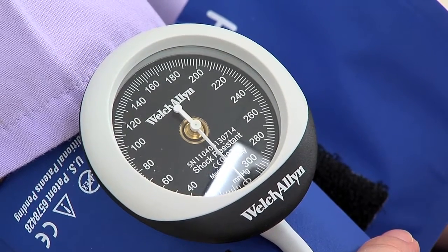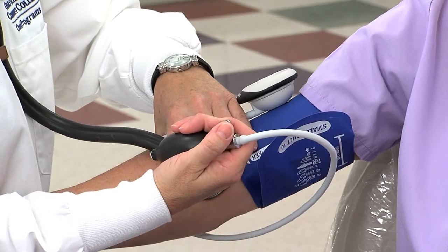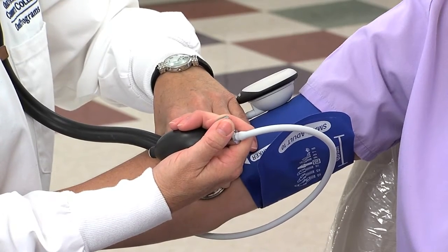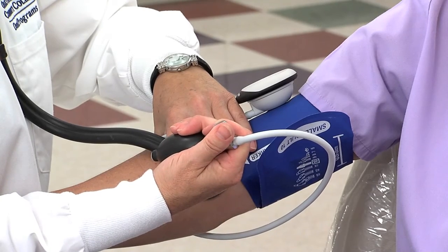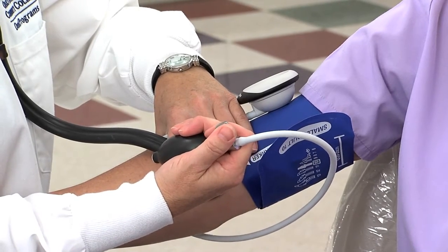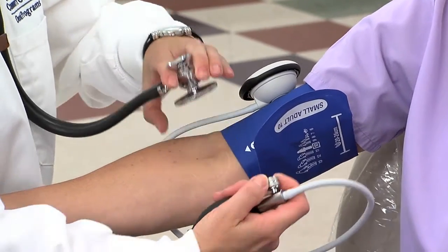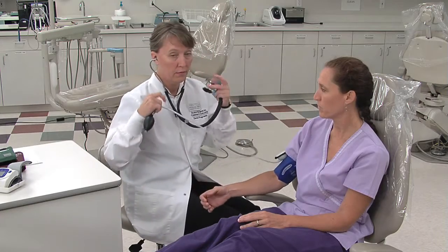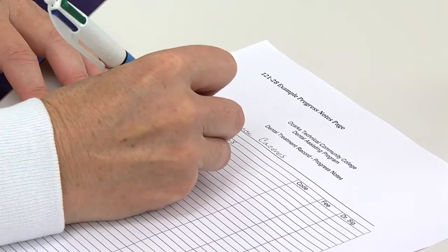If you hear the last beat at 60, you never want to just go ahead and open the valve and release the air quickly. Remain at a slow pace until it reaches zero. Once you have your two numbers, you can then remove your stethoscope and note the number in the chart.